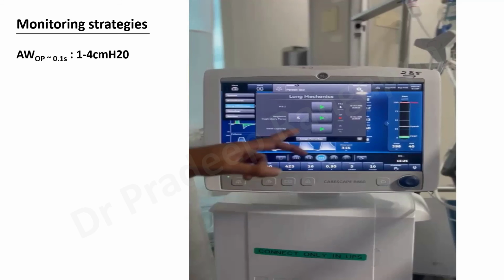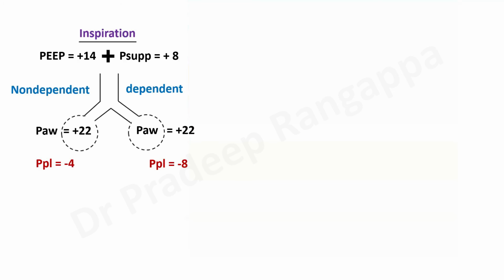So this is our understanding. You want an adequate respiratory drive. Low respiratory drive is dangerous. More respiratory drive is dangerous. So that is our understanding.